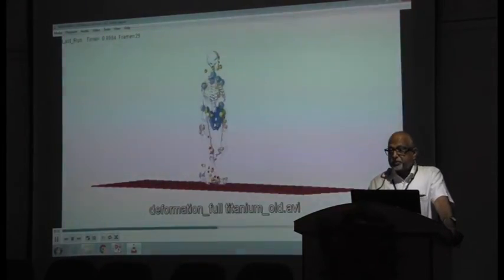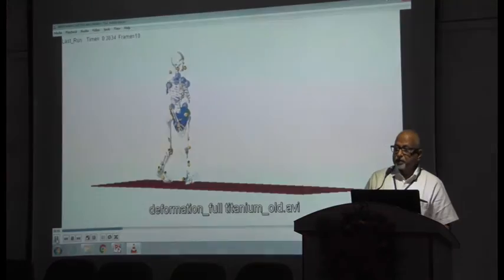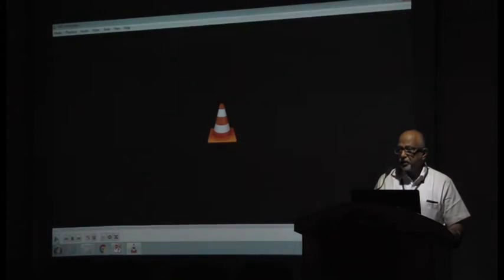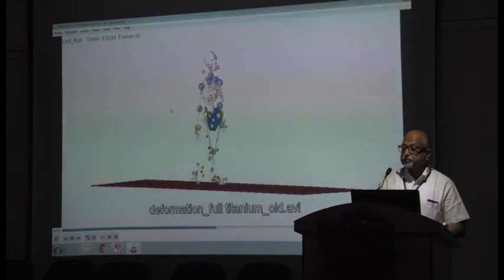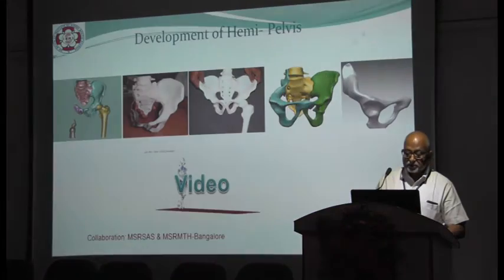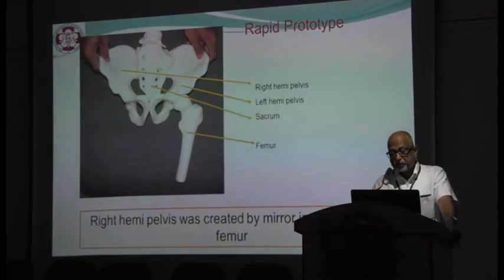And this is a software which is available, which gives us exactly what stresses are going through. You can apply various properties to the bones that you are experimenting on, and you can measure the stresses, and also look at where your fixation points have to be for your implant.